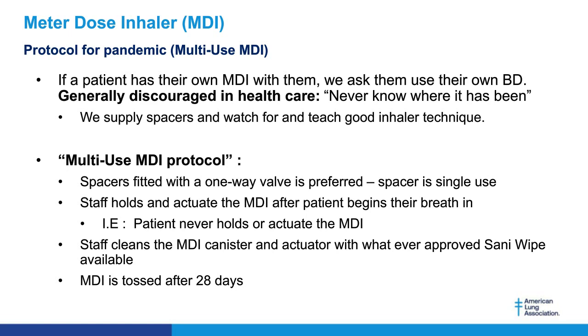We supply the spacers for the MDIs, and we watch for and teach good inhaler technique if the patient is using their own. If the patient's not using their own inhaler, we've been approved by our pharmacy to use a multi-use MDI protocol. Generally, we're not allowed to use multi-use because of the Joint Commission, so we always use ampules of nebulized therapy. And what we're doing now to try to use the MDI, which would be less aerosol generating, is that spacers are fitted with a one-way valve. This is what's preferred. That way the patient can't blow into it and contaminate the MDI. The spacer is always single use. We throw them away after every patient.